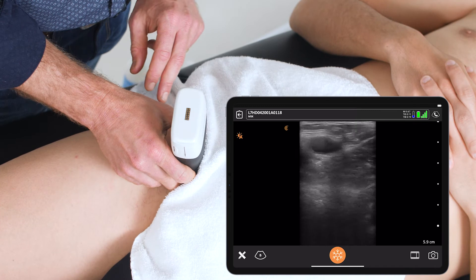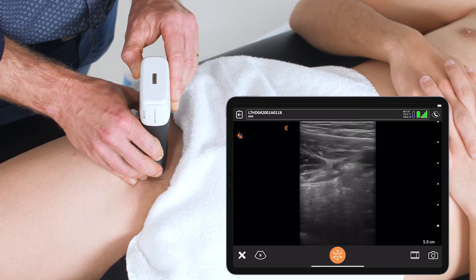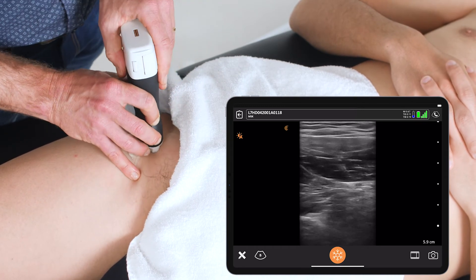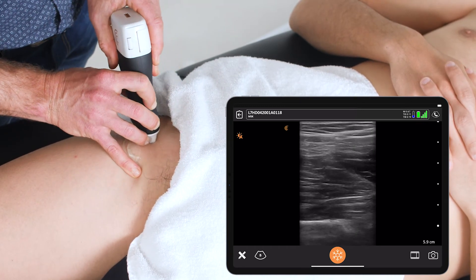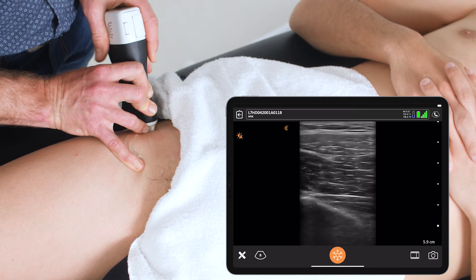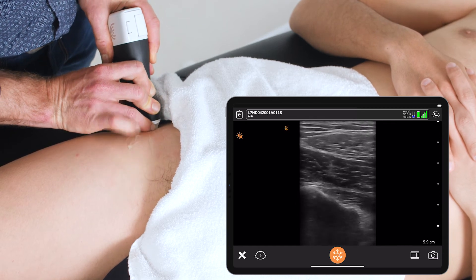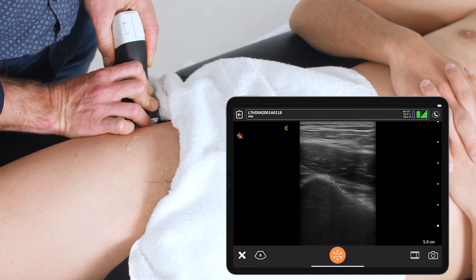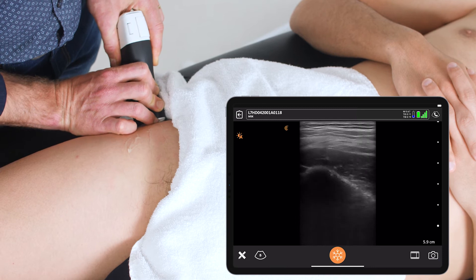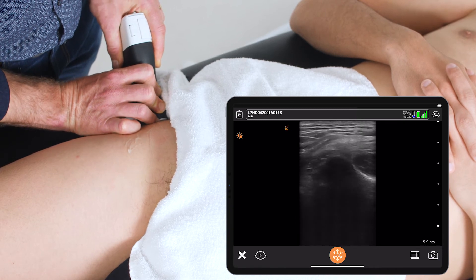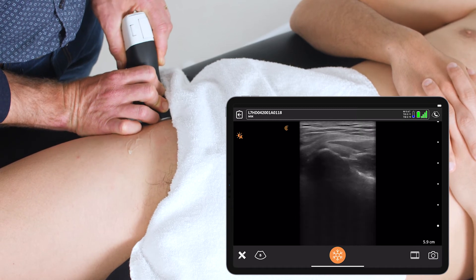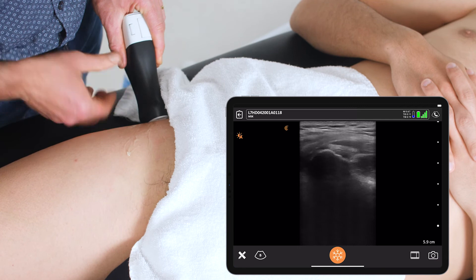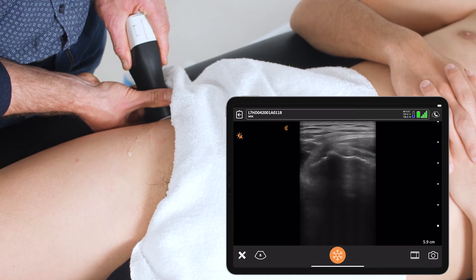And then from here, I'll come back down the femur and slide out towards the trochanteric bursa on the lateral aspect to see if I find any fluid collection in either the greater trochanteric bursa itself or some of the surrounding bursa areas.